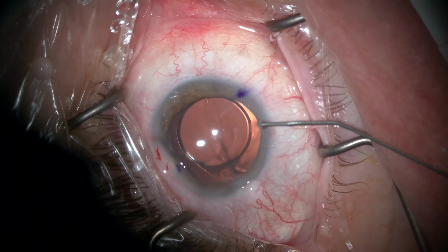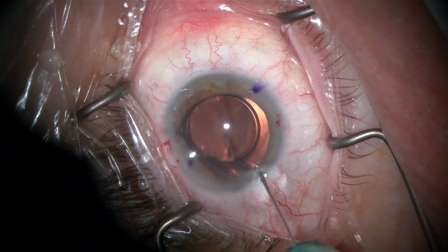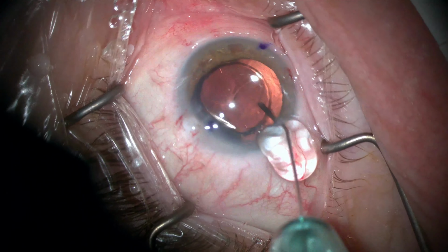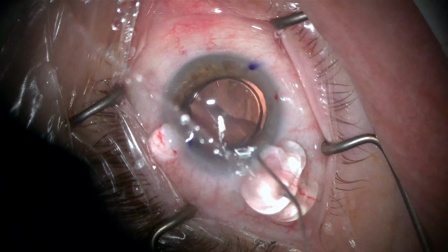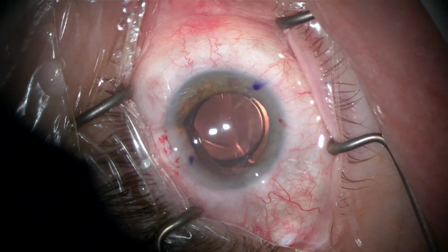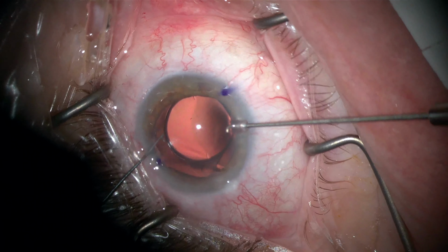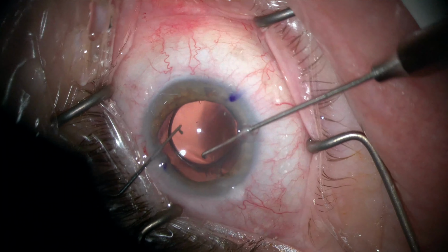So once the nasal haptic was felt to be free, I did the same maneuver in the temporal region and was able to get good mobility of the IOL. And you could see there the dispersive viscoelastic egressing out of the eye.